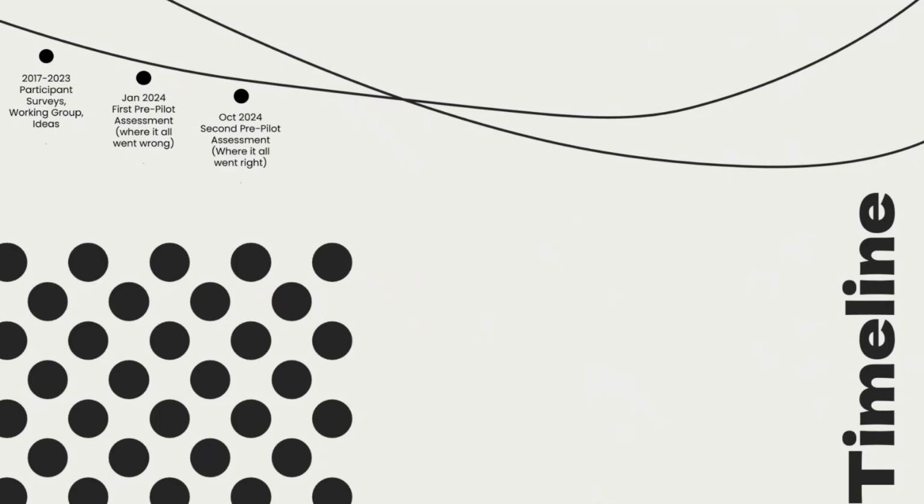We also started training assessors. Obviously all of our assessors are so used to assessing from the glass. The way it's set up in our office is we have multi-headed microscopes. Everyone's used a microscope, and we had to train a new generation of assessors who have been involved in the implementation of digital within their own organisations. It's just really important that we got assessors that have that experience.